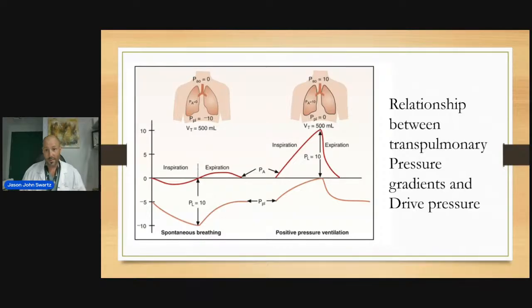If it's 25%, then you have this drive pressure that you're thinking is safe, but that's safe on a lung that is fully recruited, that has a normal FRC. The minute you start losing functional residual capacity, that means that, functional residual capacity are the alveoli that are functional and ready to take in a volume. So you can see that stress and strain has to be in the forefront of our mind.